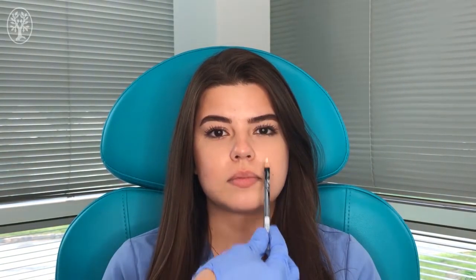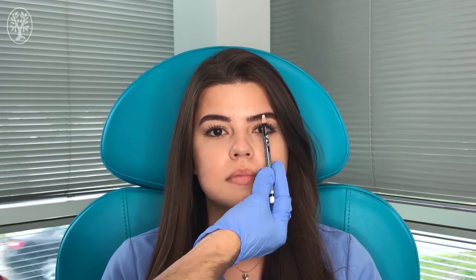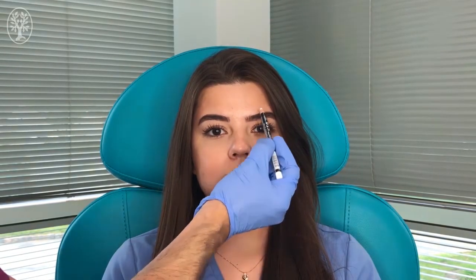The way to find the nerve is to find the vertical line that goes across the mid-pupillary line. So we look at the iris, we look at the pupil, and in a vertical line that passes in front, this is the area where the supraorbital nerve is going to be.